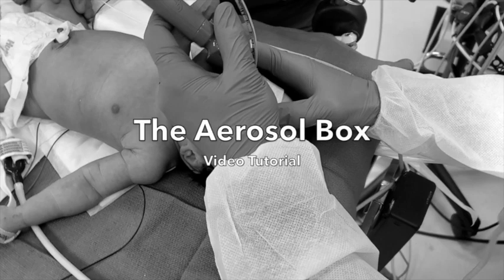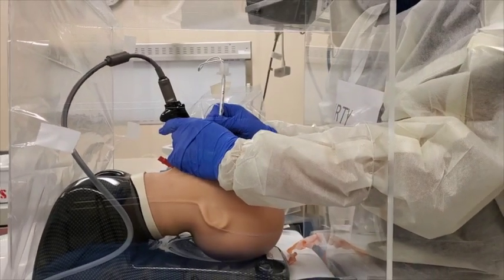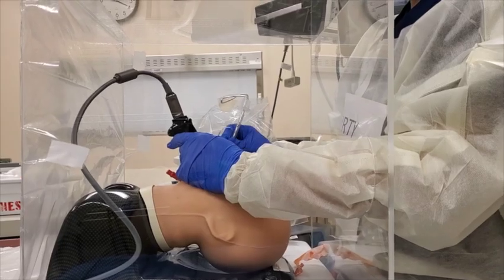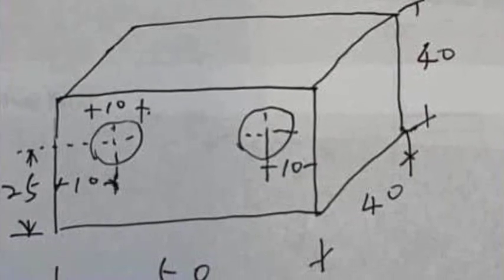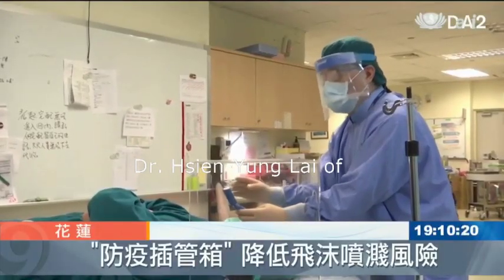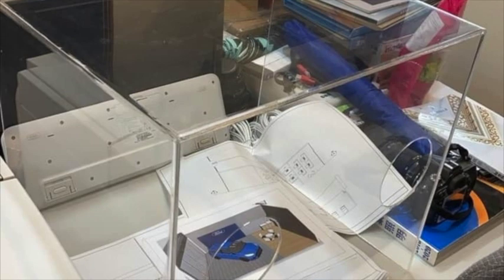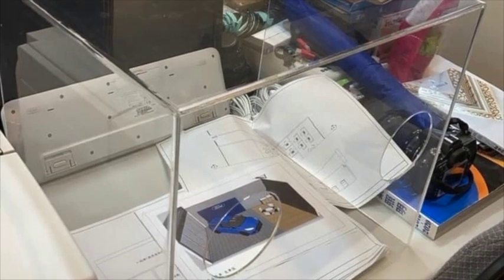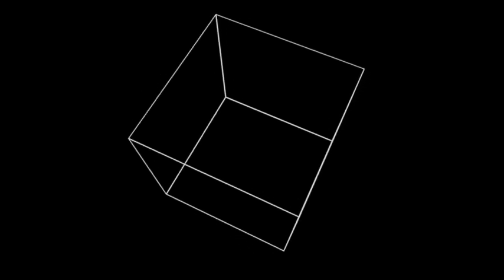Direct laryngoscopy is an aerosolizing procedure that poses a significant risk to healthcare professionals caring for patients infected with the COVID-19 virus. The aerosol box was created by Dr. Lai from Taiwan to provide an additional layer of protection for intubation and extubation. The clear box adds an additional layer of protection and is a simple and cost-effective design.